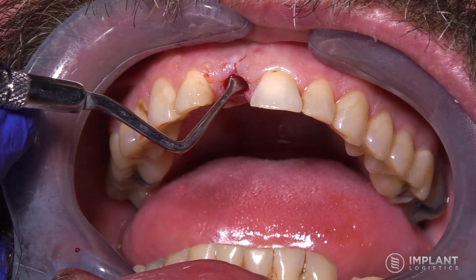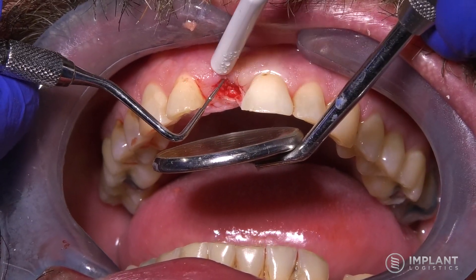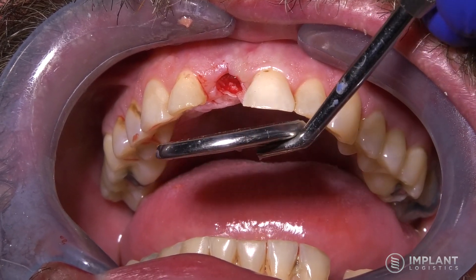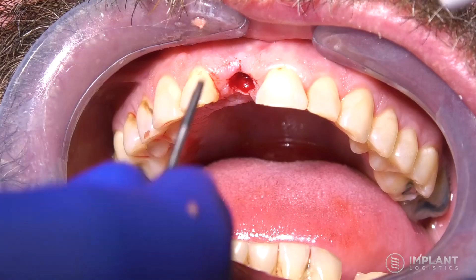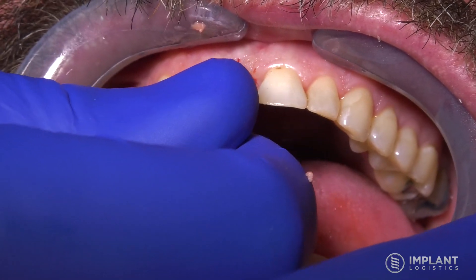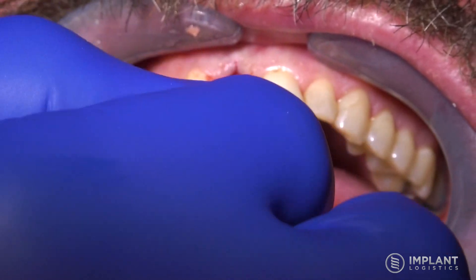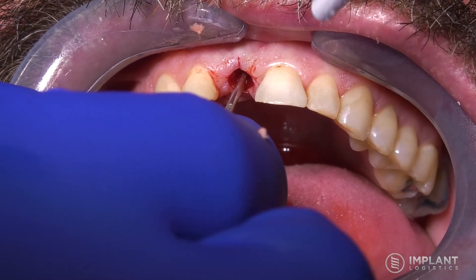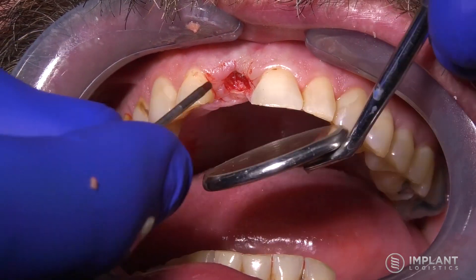When you see the titanium starting to show through is when you would stop with the handpiece and go to hand instruments to find the cover screw on top of the implant. If you happen to nick the implant with the rotating handpiece, you're not going to damage the implant, but obviously you want to minimize that contact as much as you can. You're looking at now the 050 hex tool engaged into the cover screw, turning that counterclockwise until the cover screw comes off.